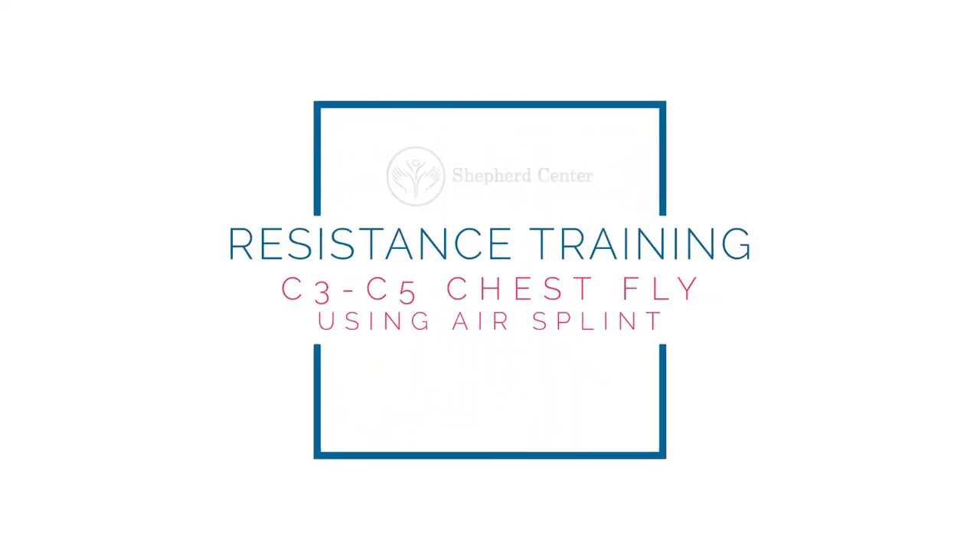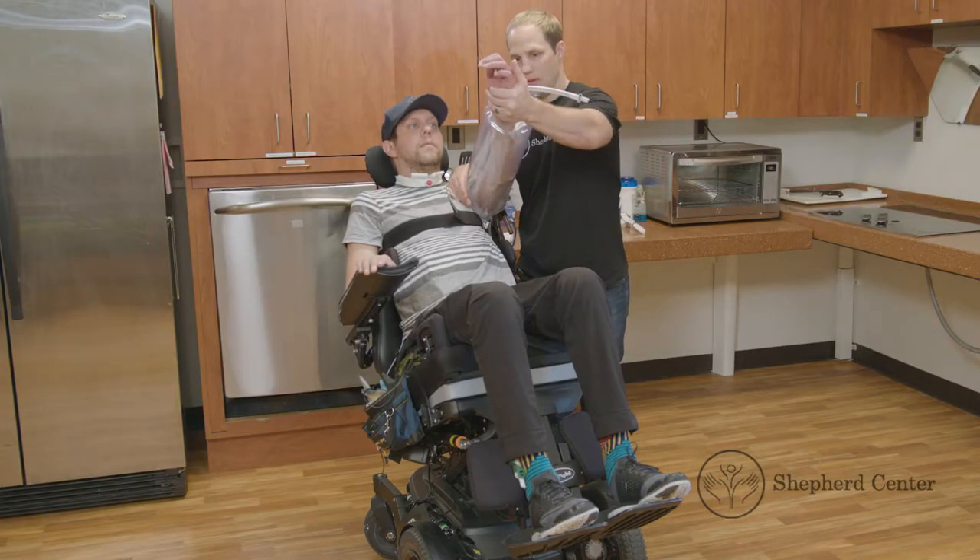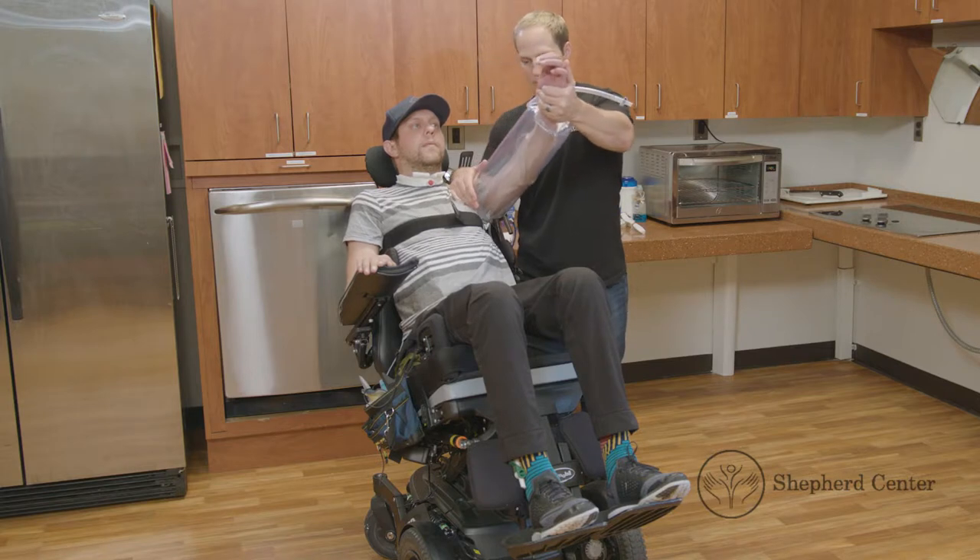C3 through C5 Chest Fly Using an Air Splint. Position the chair with a slight recline and secure the chest strap. Remove the armrest for each side you are performing the exercise on.